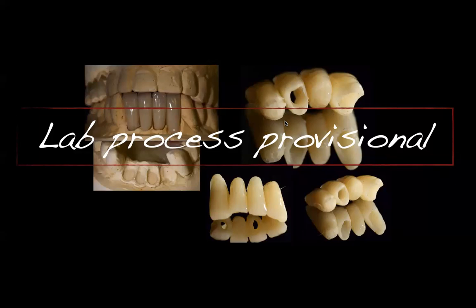Really, really overbuild it, because it's always easier to drill out acrylic as opposed to putting more acrylic in. So have them do that. Because if I want to have this case as a screw retained, I'm going to end up in this area, and all of a sudden I have zero acrylic beyond it.